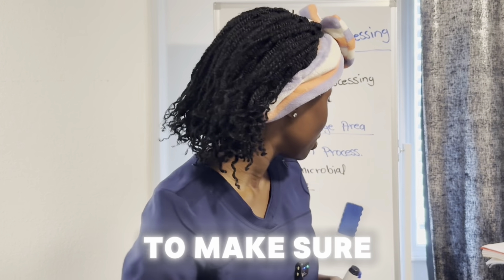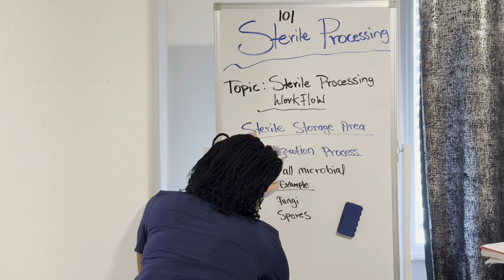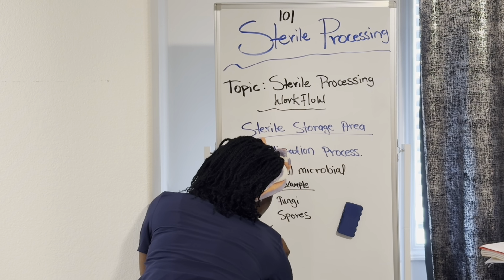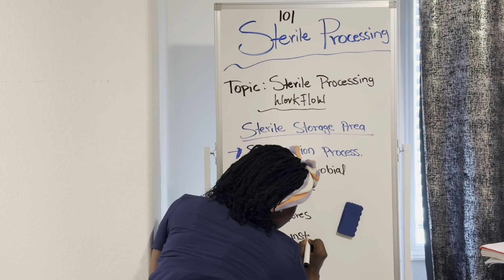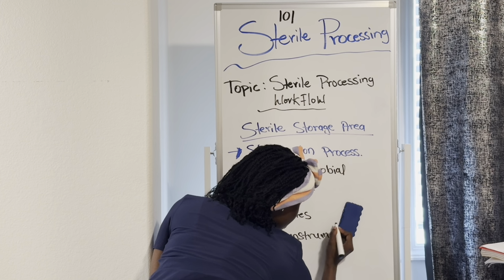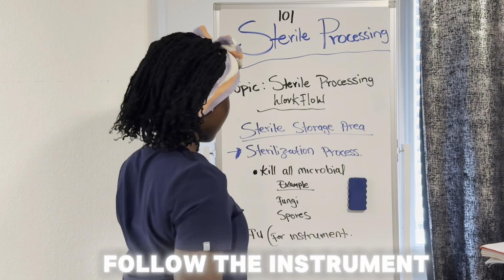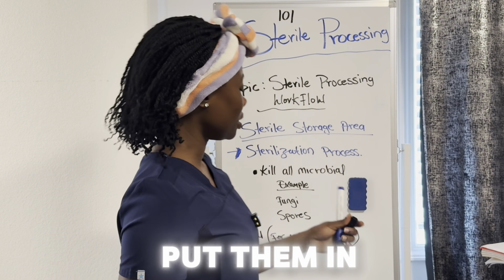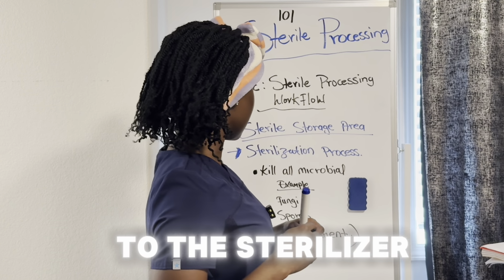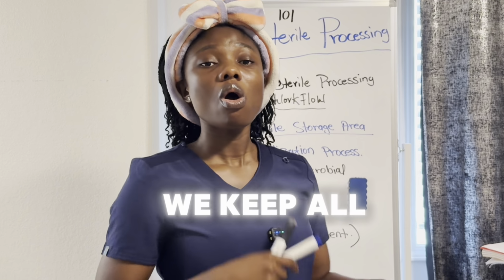So we have to make sure we follow the instrument IFU before we put them into the sterilizer.